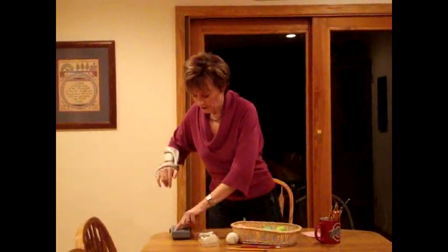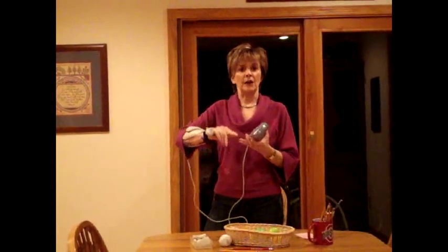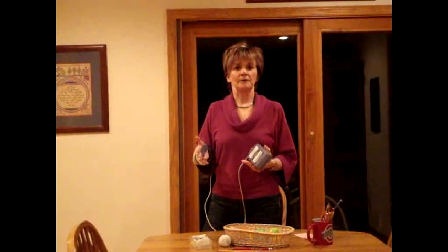After I got pretty good with that, I'm going to turn this off for just a second, I went to my pantry, which I'm going to have my husband video me in the pantry and show you what I did in there. But I picked up the soup cans, and again, every time it opened up my hand, I watched it and I said, I'm opening up my hand, I'm picking up whatever the object was, I'm putting the object down, because I wanted to use all my learning styles, seeing, hearing, and doing. And I think, again, I'm not an OT, but that just seemed to make sense to me for rerouting the brain.